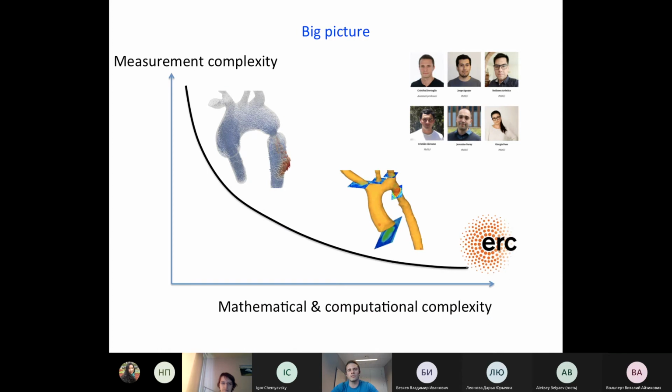In which direction are we going actually? We believe that we want to go further with the quality of data. We want to be able to tackle worse and worse data. And why? Because then you can also speed up measurements. When you can handle bad data, you can ask the radiologist for worse quality measurements, so for quicker scans, and then you can still do something with that. That's the direction that the group is going, and that's part of the project we're running now.